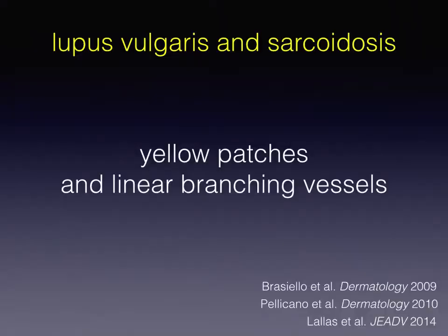Here is another papule of lupus vulgaris, again displaying a yellow background color and linear branching vessels under dermoscopy. This is a lesion dermoscopically very similar to the previous one, but with a different diagnosis — in this case, sarcoidosis. So, the pattern of yellow patches and linear vessels is highly suggestive of a granulomatous skin disease, but insufficient to differentiate between sarcoidosis and lupus vulgaris.